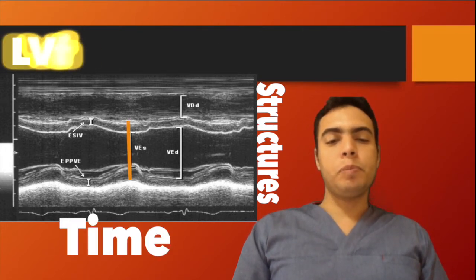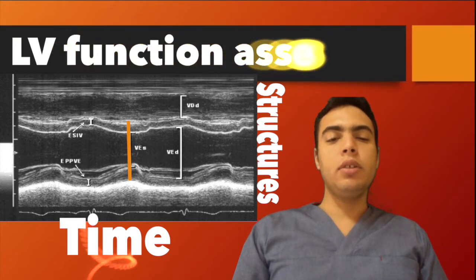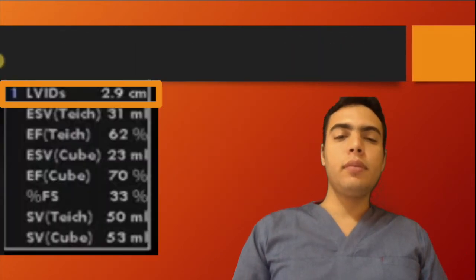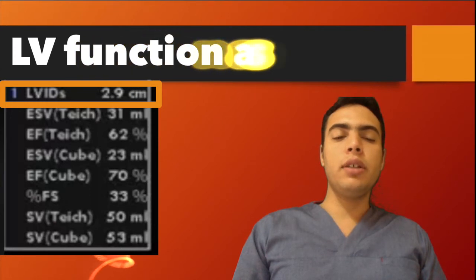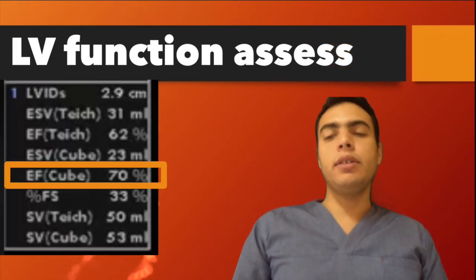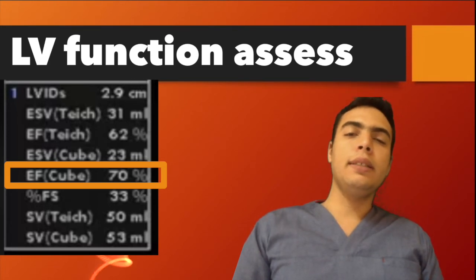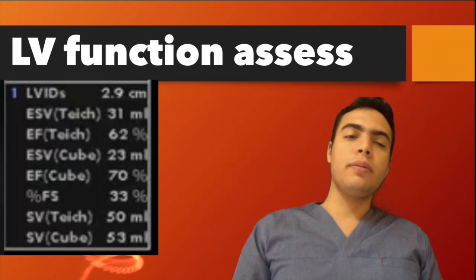Then you sign the same measurements during the systole as seen here. Then the device will write you the ventricular dimensions and the 2D dimensions of the ventricle and the ejection fraction, which normally shall be greater than 55%. If it is lower, this means there is reduced ejection fraction.